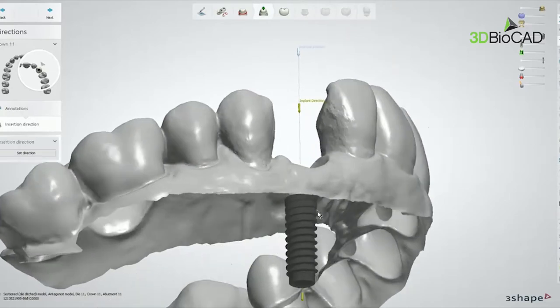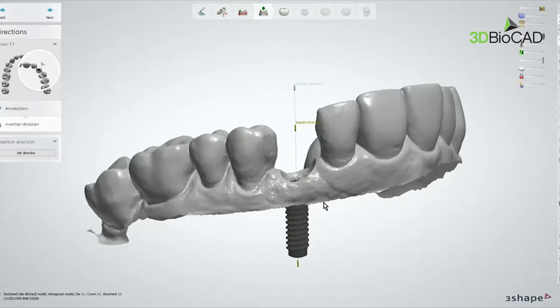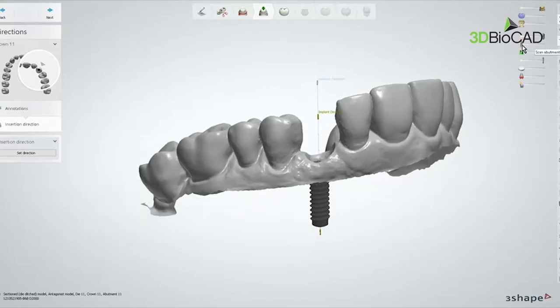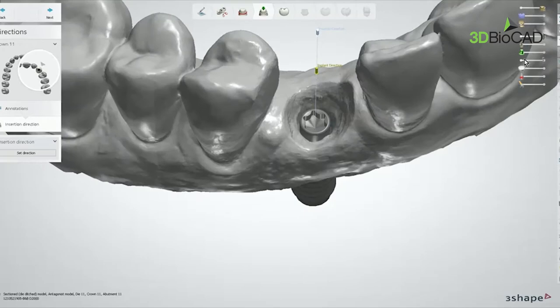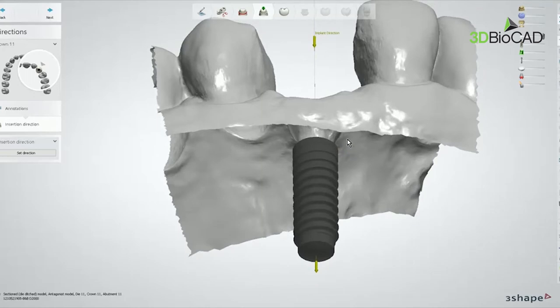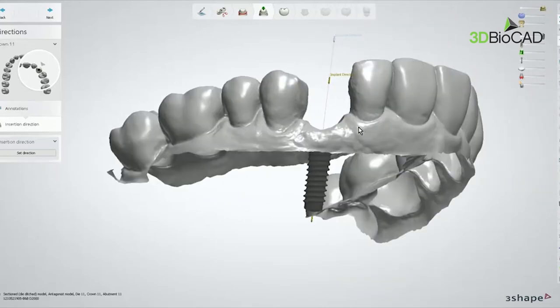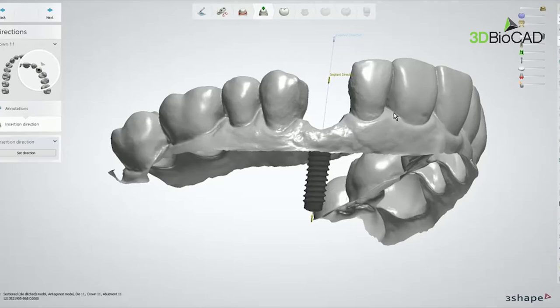We have the implant fixture positions there virtually. So at this time, we can think the scan body scan has to be good. That's why the scan of the scan body is the most important part to having the right and correct implant position within the scan. Merging the scan body is super important too, because sometimes the implant position can be lower, or go down more, or up, or rotated. So for avoiding mispositioning of the implant fixture position, make sure the chairside scan body is scanned well, and the lab side merges the scan body well.